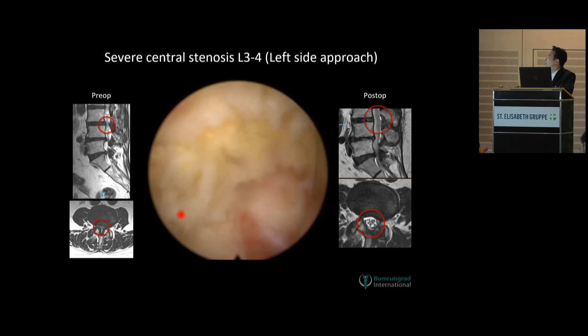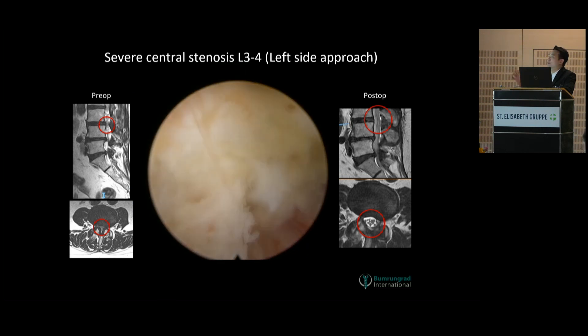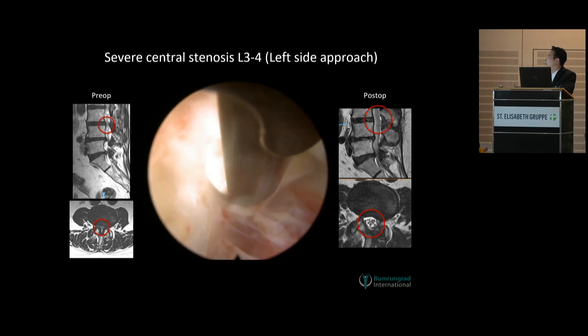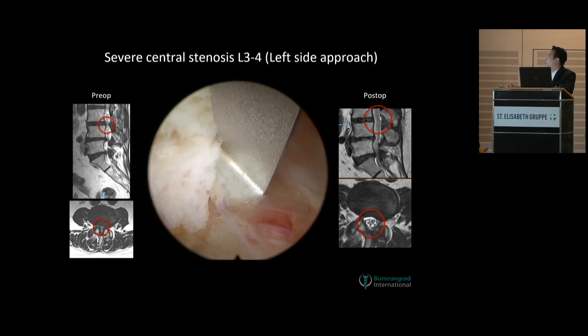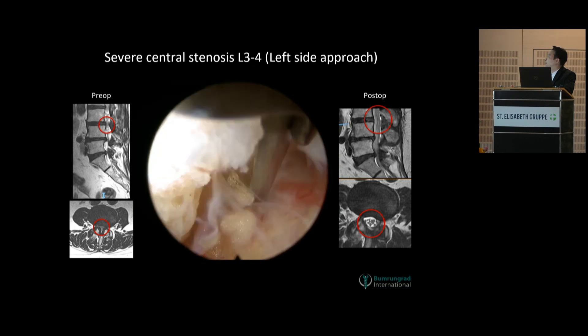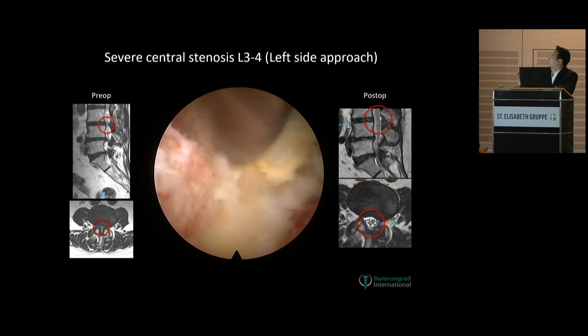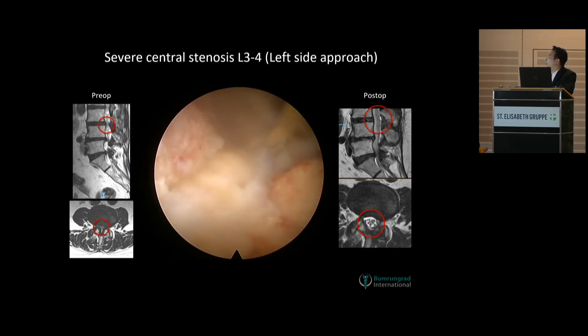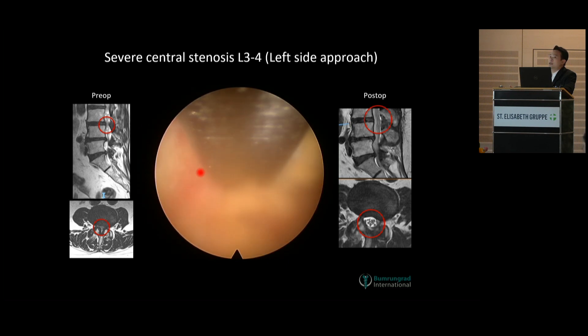As you can see here, this is like a flap, so cutting like this is not so effective. That's why later on I'm going to open up the space at the insertion cranially to remove the flavum more effectively — like this. So I cut the bone more. Now I have the insertion cranially already.